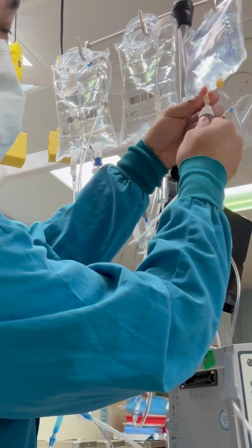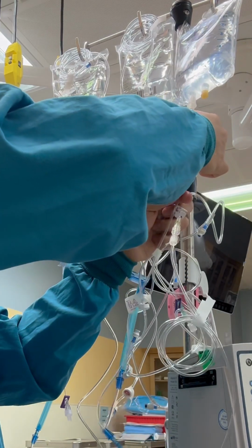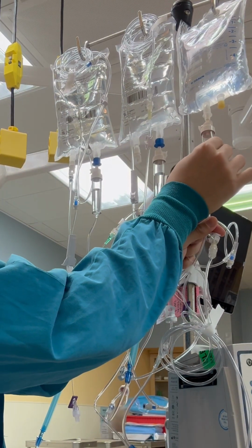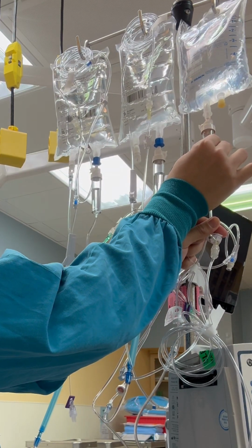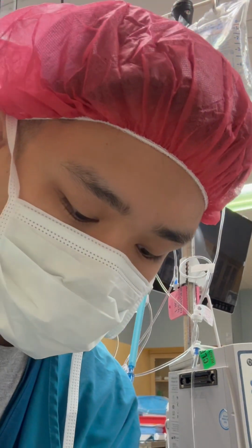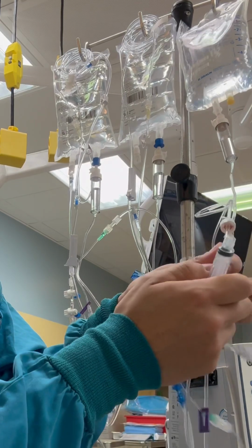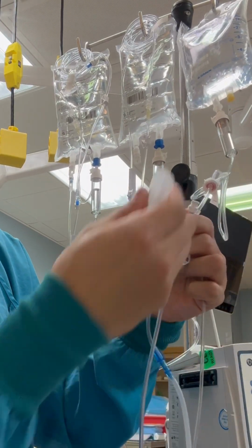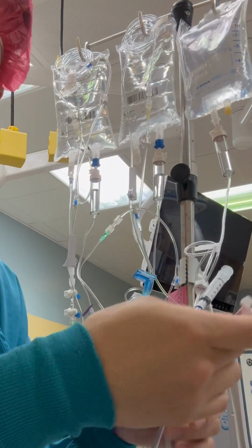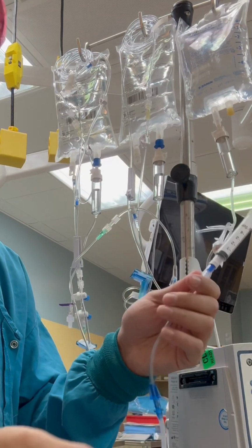Now, when you spike the bag, you want to make sure that the chamber is extra super full, just to make sure that no air gets into the line, even if the fluid somehow runs fast. Now, what you need is a 5cc syringe. The reason you want the syringe is you want to be aspirating air out of all of the ports when you prime the line. Even if you prime a line perfectly, there will still be air that gets caught in the chamber of each port, so we want to aspirate that out.